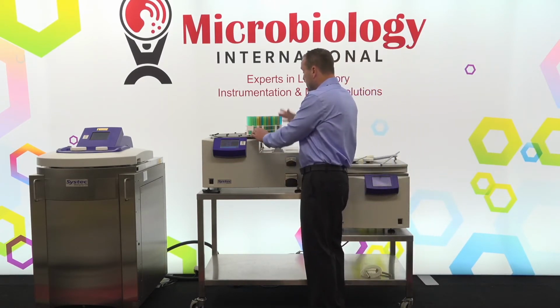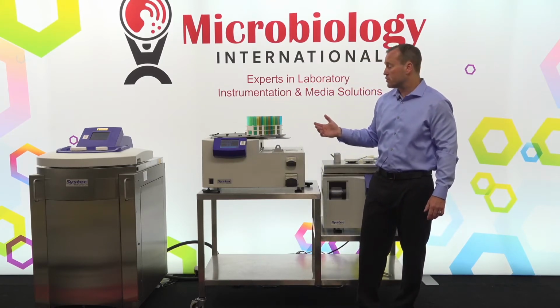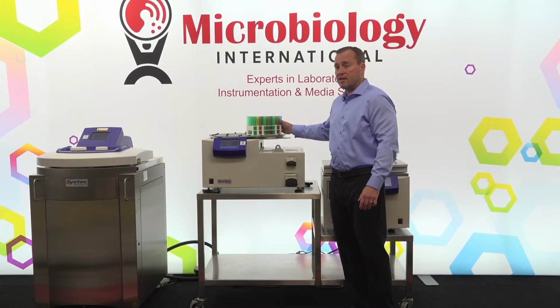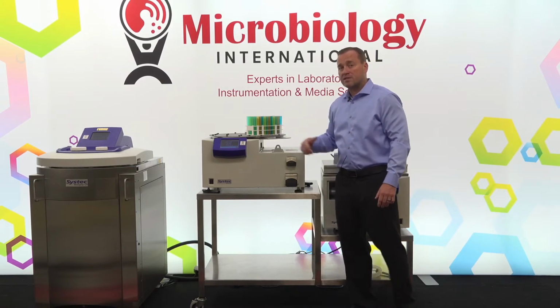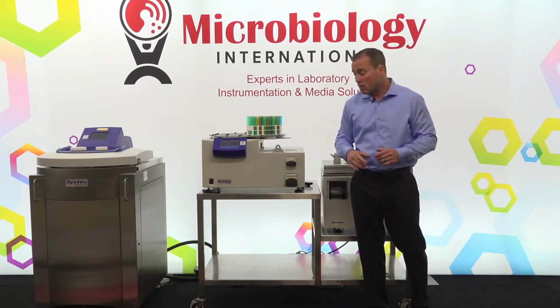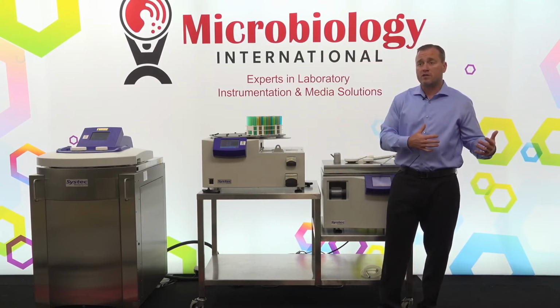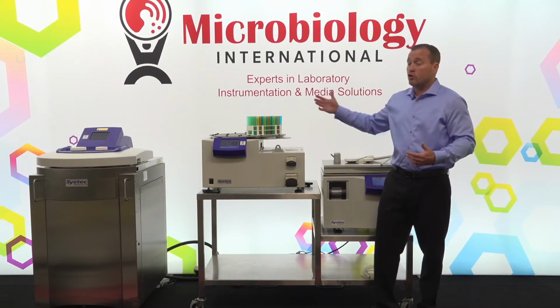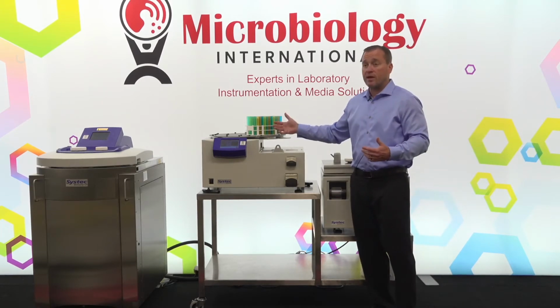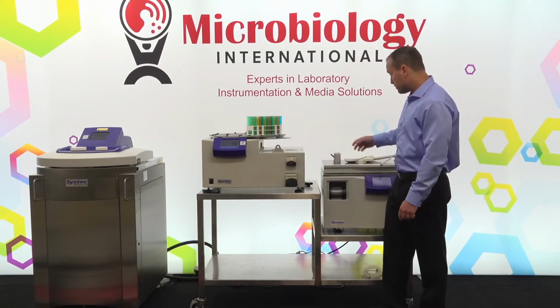So with the 16 millimeter tubes, which we found to be probably the most popular tubes that folks use, we can fit 60 tubes in each rack. Since we have 4 racks, that's 240 tubes that we can fill with just one press of a button. So tube filling is also something that we do, and we offer these tubes commercially, and we utilize this process every week, every day, in order to fill tubes that we're actually sending out to customers.